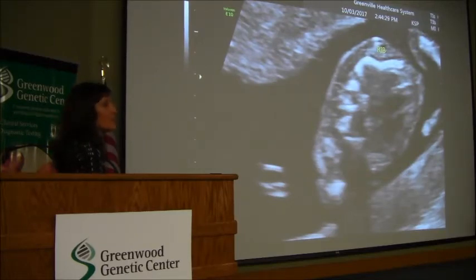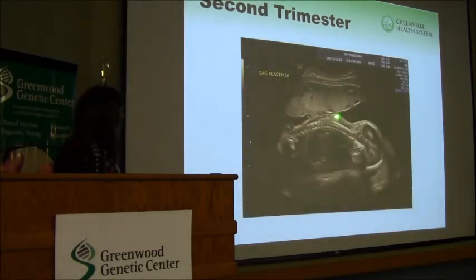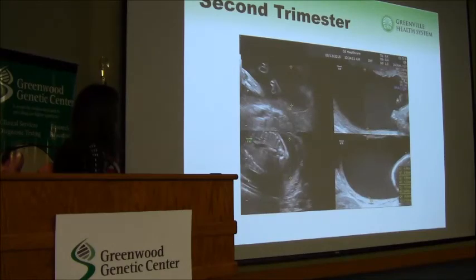You guys are the experts. Whenever I have a skeletal dysplasia of any kind, I just tell them what I see, and one of our smart geneticists tells me what it is. This is just another example of a fractured small humerus. And then just to remind you, we can see the details in terms of the vertebral bodies to know if they're hemivertebrae. We've gotten to that level now.